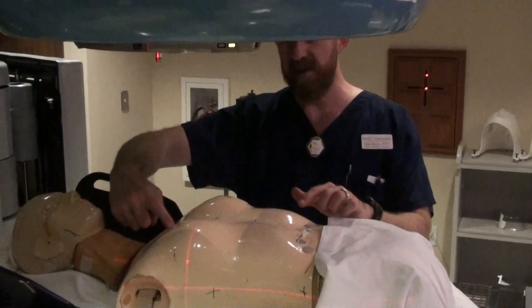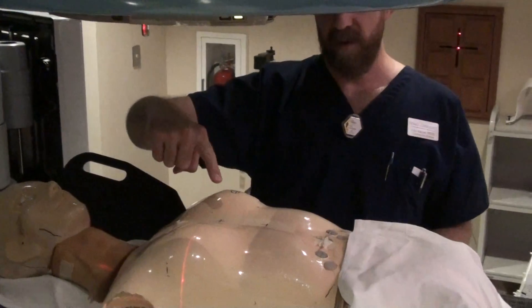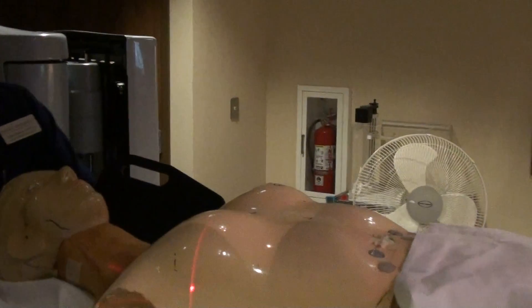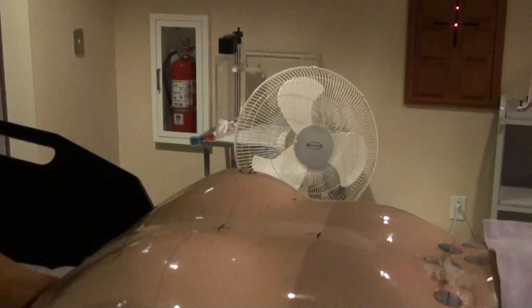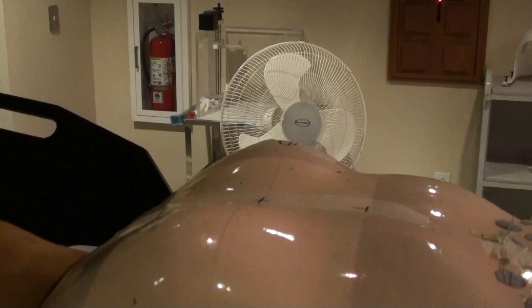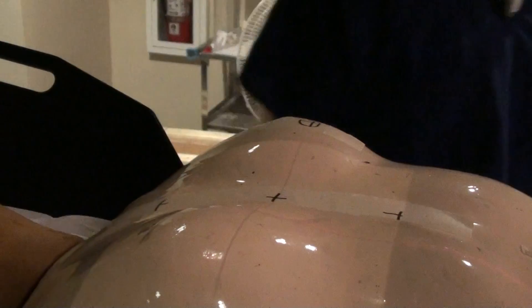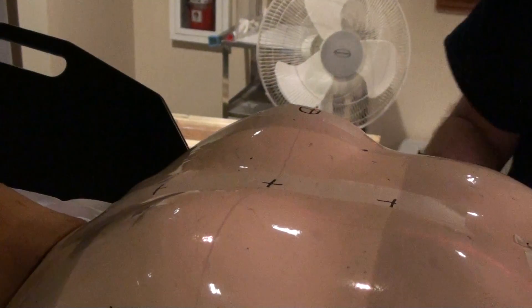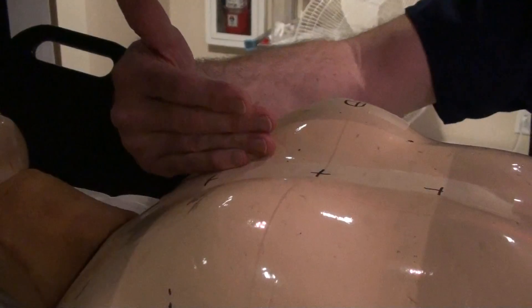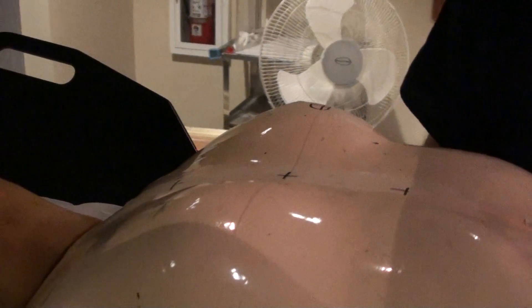In this particular case, you can see that the patient is not lined up in three points, even if we are on the CR. So what you need to do is move your entire patient and get them straightened out. We talked about something similar to this when we talked about extremity treatments — this is the same thing on the chest. I got all three marks on the same side of the CR; everybody's on the same side of the fence. Then we go left-right to try to line them up.